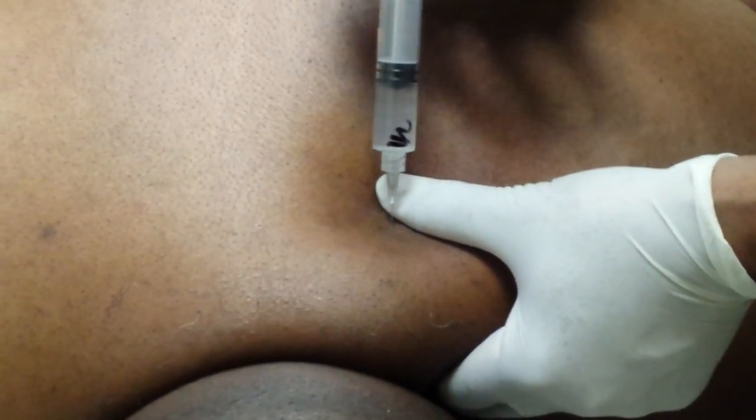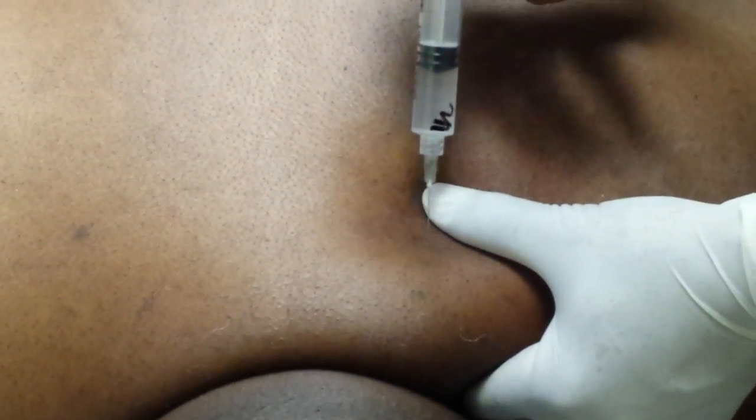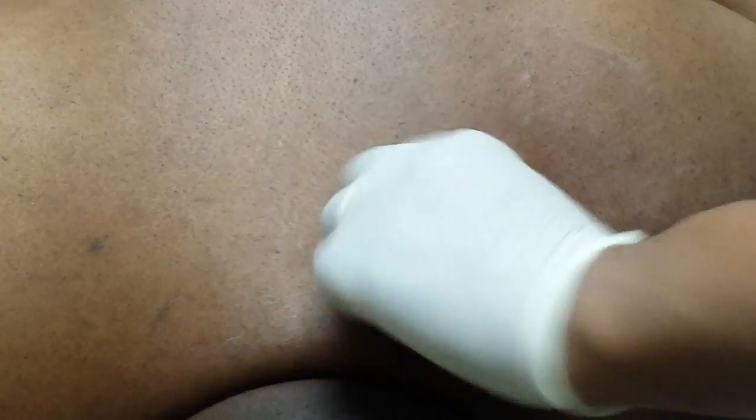What I'm going to do is go over a little bit and up here. If I can get this in here — pinch. It's just grabbing, it won't even go in. It's bending. I'm going to have to get a larger needle.